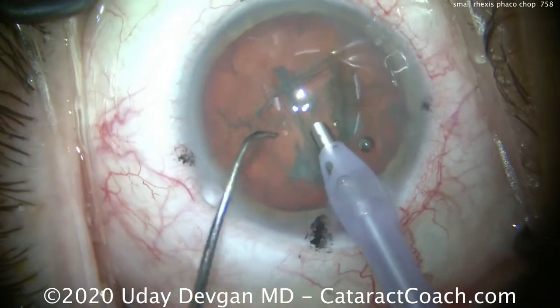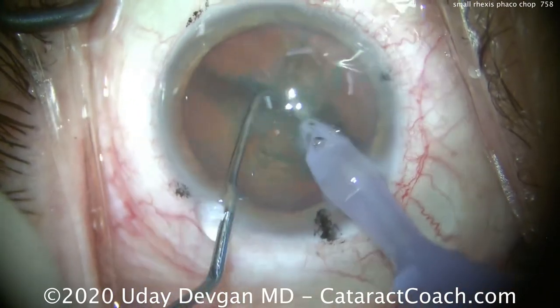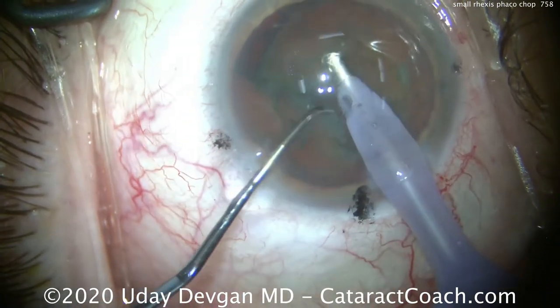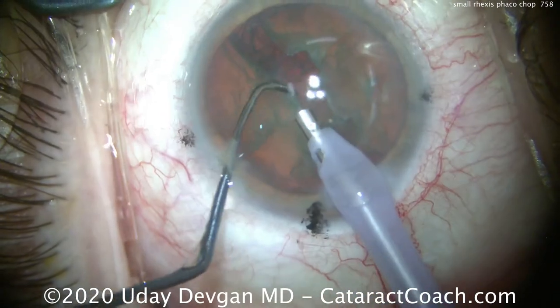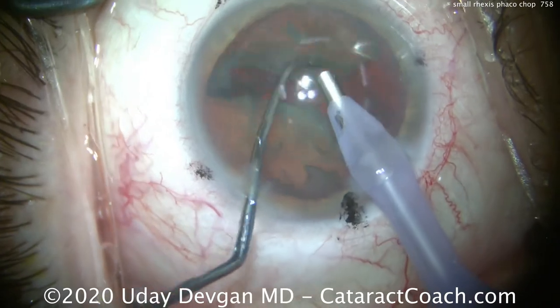It's probably going to be about 4.5 mm — so here's the chop part. Buzzing in with the phaco probe, the chopper goes in and we have two halves immediately. But it's going to be difficult to bring out one half completely, so we'll bring up a corner instead and then chop off a piece. The capsulorhexis is a little bit smaller, so it's hard to bring up an entire heminucleus after just the one chop.